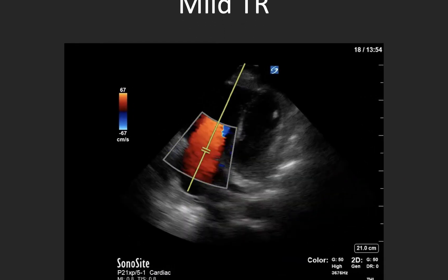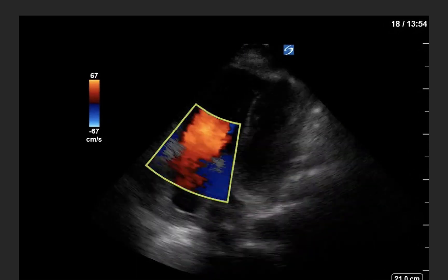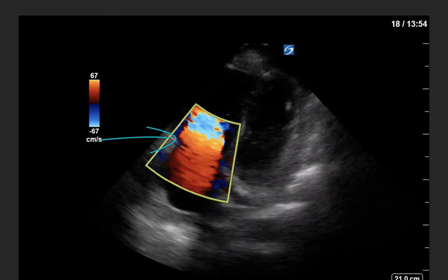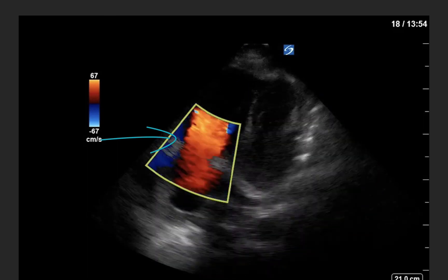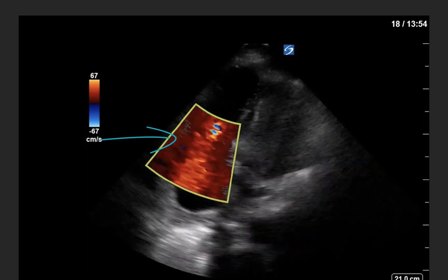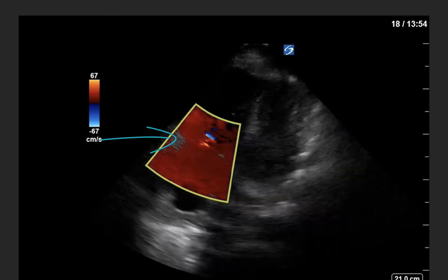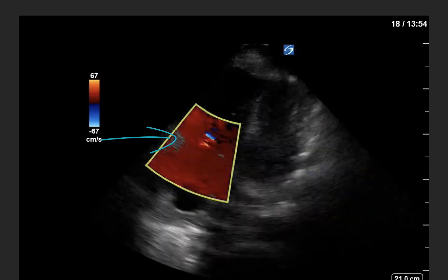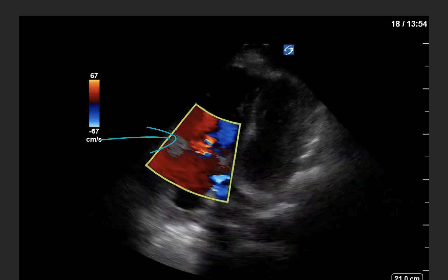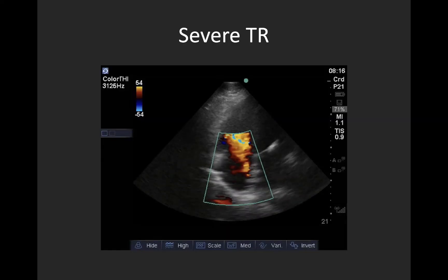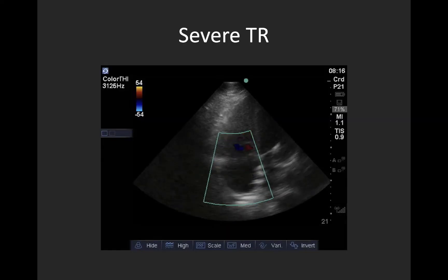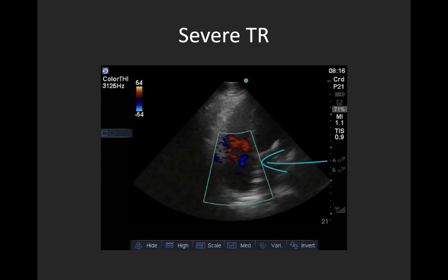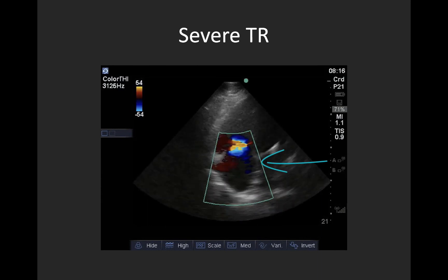Here we have non-severe, likely mild tricuspid regurgitation in an apical four-chamber view — that little blue jet coming backwards through the tricuspid valve in ventricular systole. Tachycardia can make it harder to see small regurgitant lesions, so try to slow down the clip or freeze and scroll. And here we have an example of severe tricuspid regurgitation — notice that this big blue jet occupies at least 50% of the right atrium.